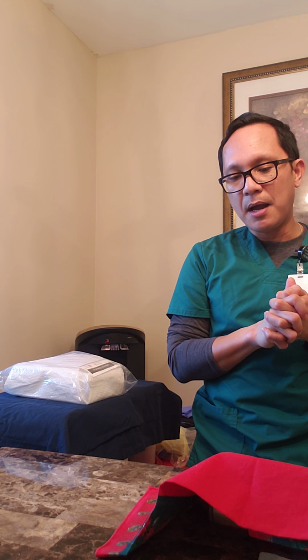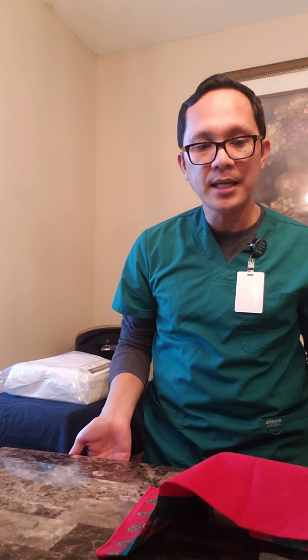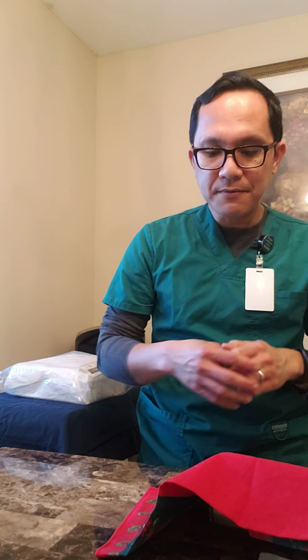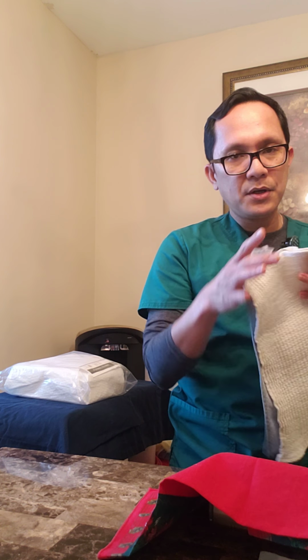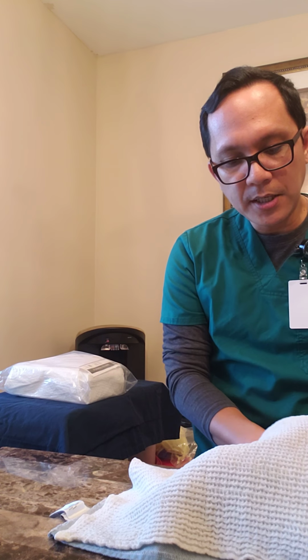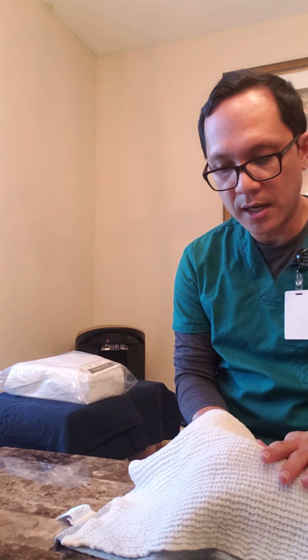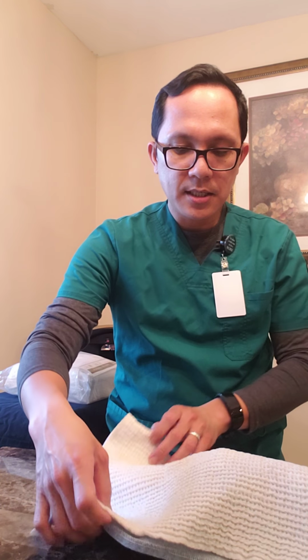Okay, Mrs. Smith, I just want to make sure that you're comfortable. I'm going to bring your bed up high, okay? So it's an easier, more comfortable working height for me as well. I want to make sure that the patient is in supine position. Can you flex your knees for me? All right, let me just cover you with a bath blanket, so when we take your bed sheets and covers out, it doesn't show all of your body, okay?